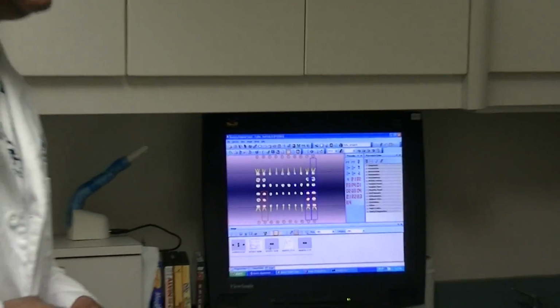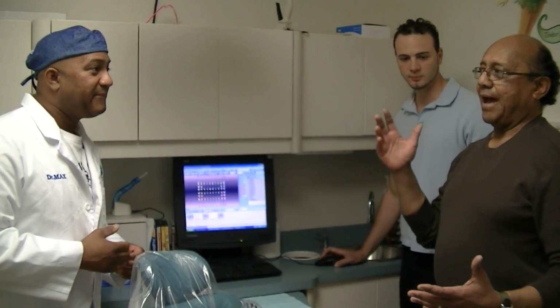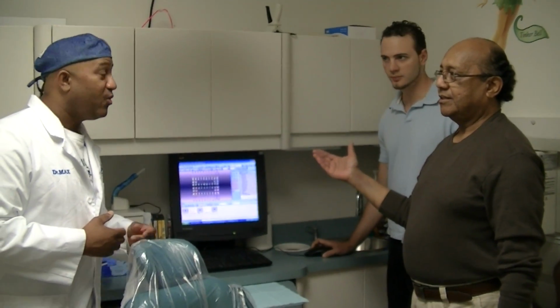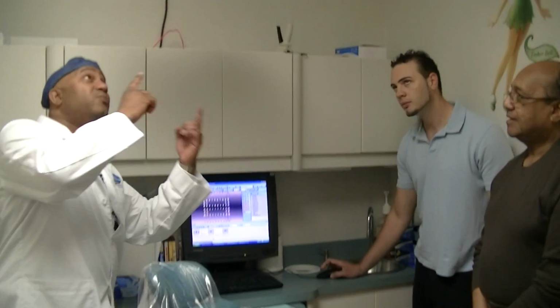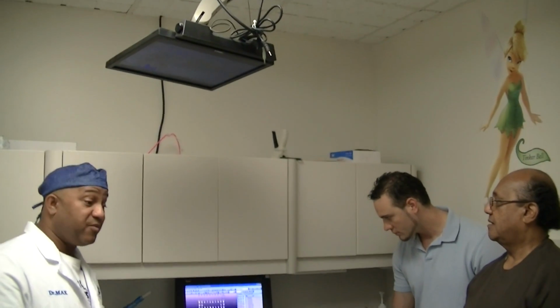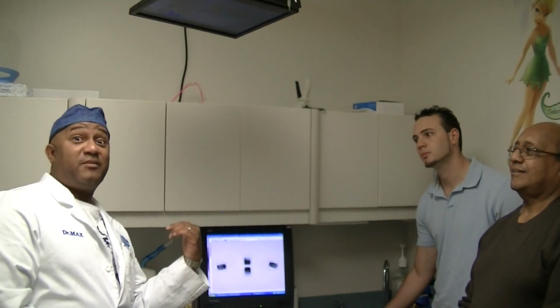Dr. Max, also, how about the patient? If you wanted to show the patient something about their treatment or about their diagnosis, can you share that information with them from this screen? Great question. Actually, what we do is we have two screens. We have one here and we have one above. We use this for just what Mr. Maxwell was saying, sharing information rather than patients sitting here and trying to turn around and look at that monitor.